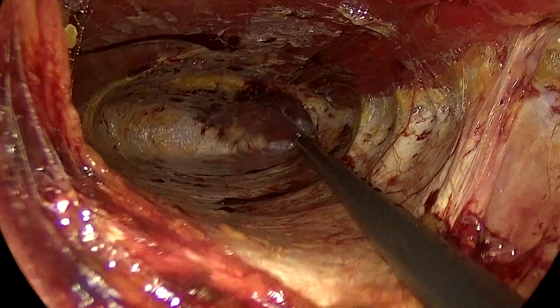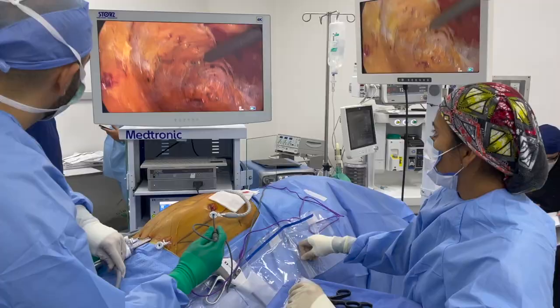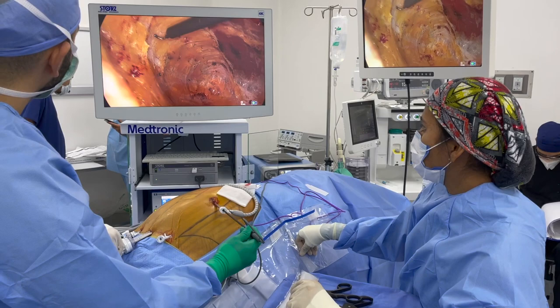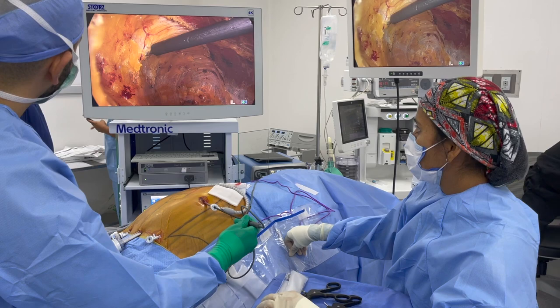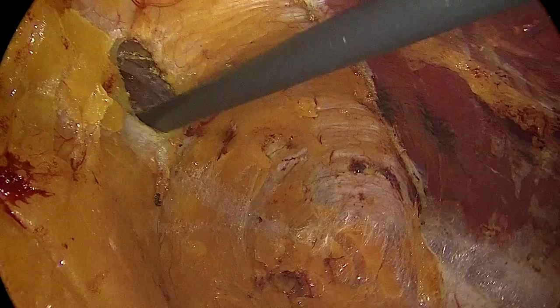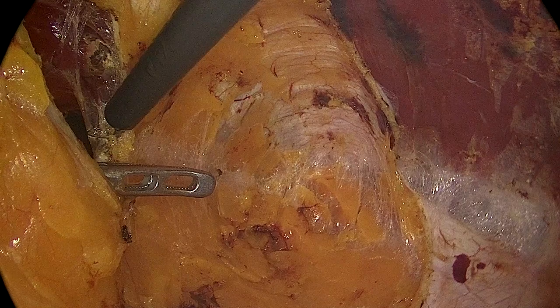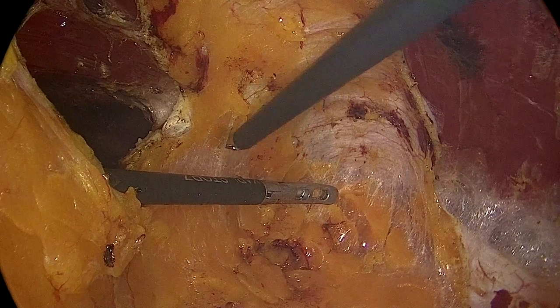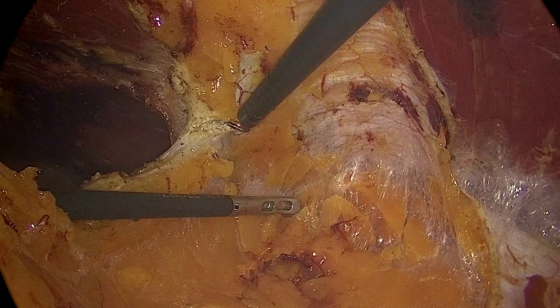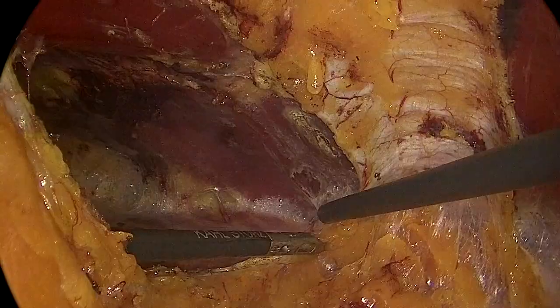Now we turn our attention to the right retrorectus. We introduce the clamp and this clamp is going to help us notice where the dissection of the other side has been done. With the same angle, you enter the right retrorectus space, making sure you are pointing to the area where you want to do your incision in the posterior rectus sheath. This provides a safe entry into the contralateral right retrorectus space. You pass your clamp through the small gap you just created, using it for counter-traction to create a plane making dissection much easier, while preserving at least one centimeter of fascia on your side so you can suture that later in the case.